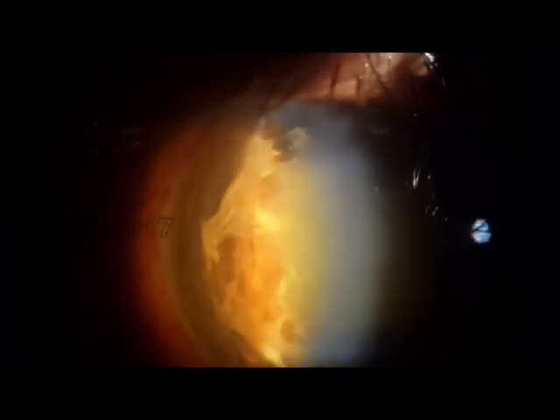As an ophthalmologist, we would not like to see a post-op condition like this, so we are presenting this video to help you with a few tips towards OT asepsis.